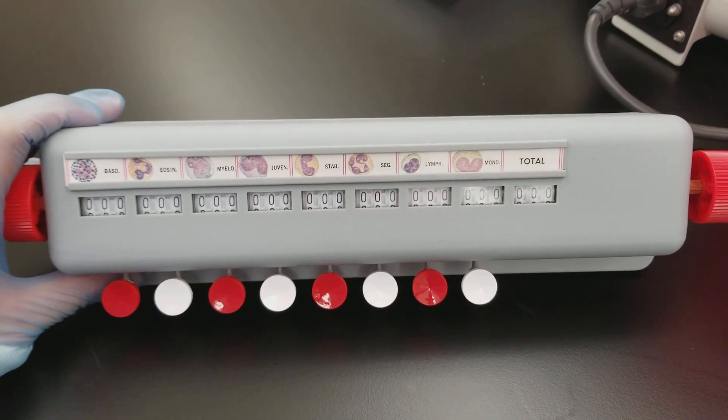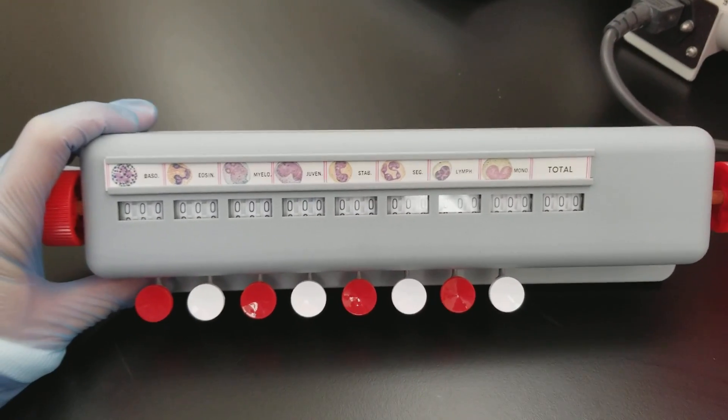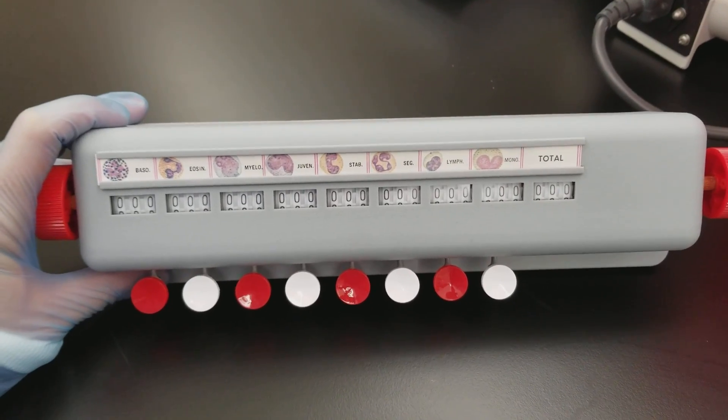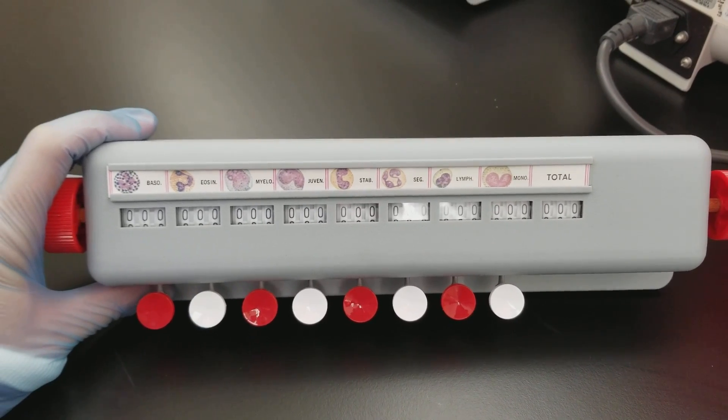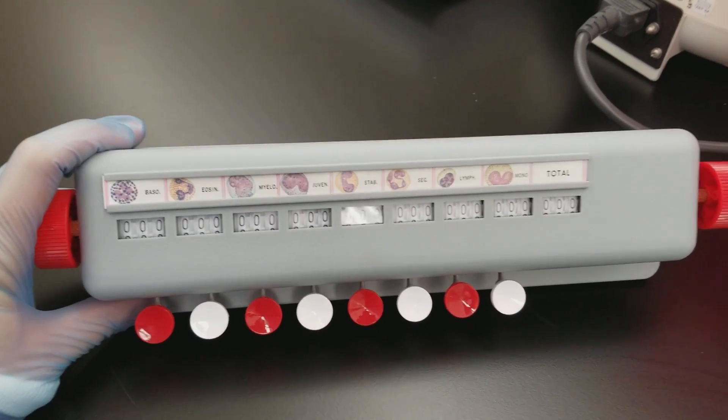You also do a blood smear review when you're doing a WBC differential. You're looking for any cell clumps on the outsides of the smear.